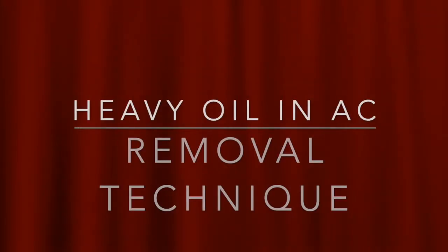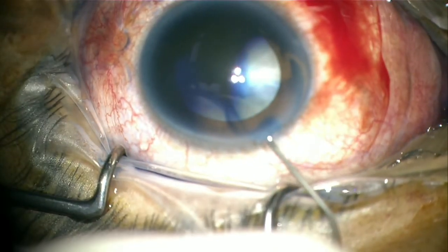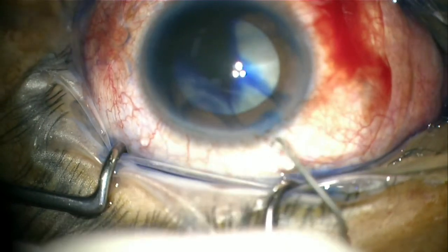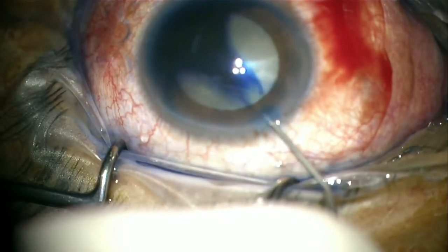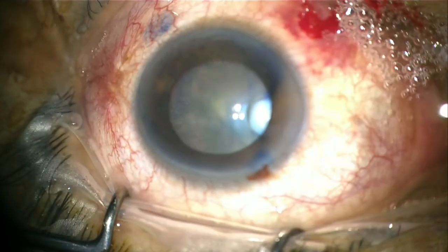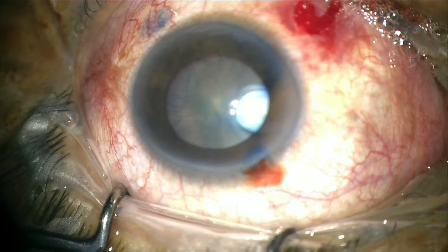This is a case of a post-vitrectomized eye with a large tear and heavy oil in situ. Removal of heavy oil requires a good view of the fundus, as the heavy oil sinks. Therefore, removal of the cataract is needed before we proceed with the removal of the heavy oil.